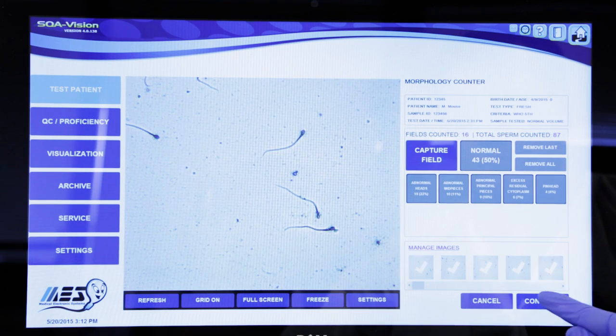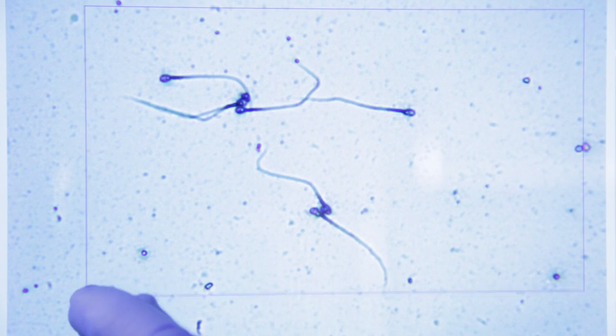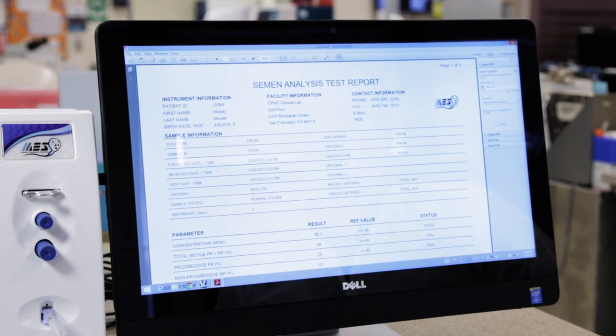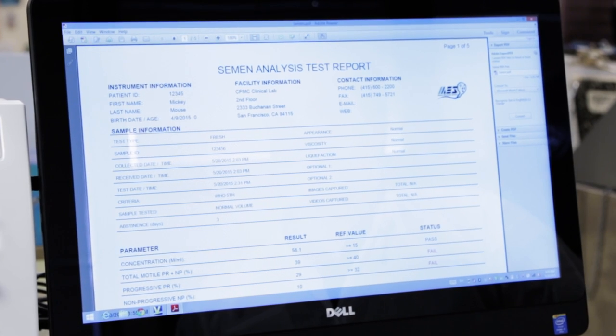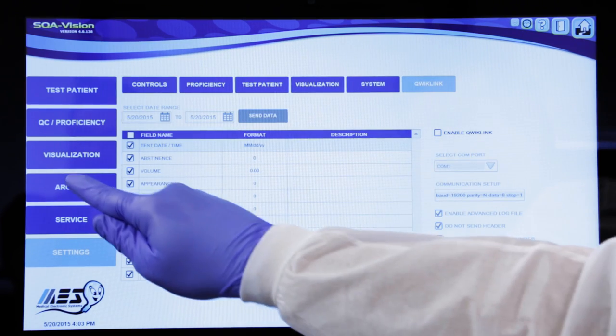For a closer look, digitally expand the image sperm by sperm simply by dragging your finger over the desired field of view. When your analysis is complete, results can be printed, sent to your LIS, and automatically archived for future reference.